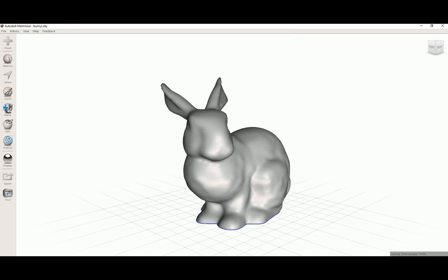Since the last time I have uploaded something, I've joined the D3 Tool team. If you're not familiar with D3 Tool, go to d3tool.com. Join the D3 Tool Facebook group. You can get more details and information there. But essentially, we're just a small group of software developers that are passionate and motivated for pushing the digital dentistry envelope forward, and really just innovating new things and trying to see what we can do.